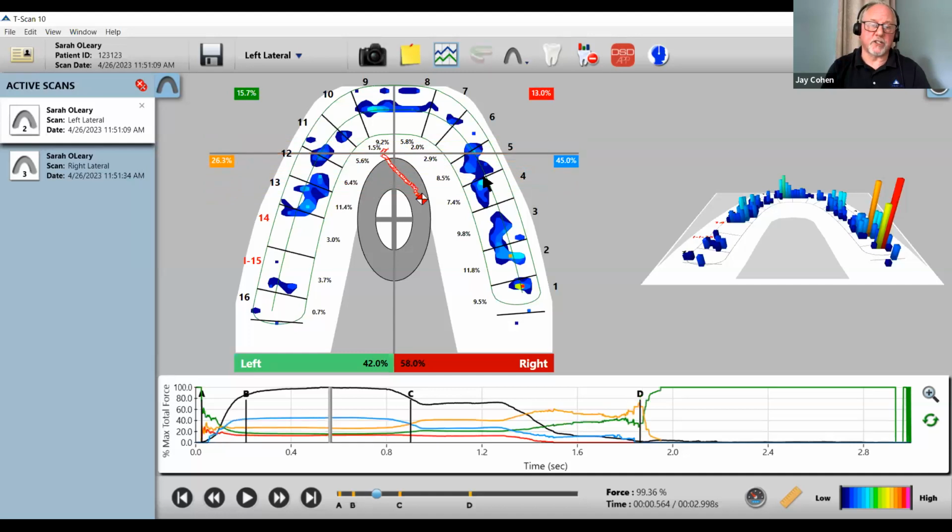You notice that it is a straight line, so it does sometimes cut through the other tooth. Unfortunately, in this case, the arch is curved, but the line is not. So that's something that we have to kind of deal with. And so once I've determined anterior from posterior, I can now get the 4 quadrants and the goal.